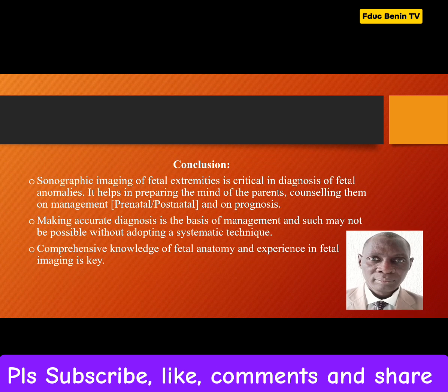Now, distinguished ladies and gentlemen, let me conclude this presentation by saying that sonographic imaging of the fetal extremities is critical in diagnosis of fetal anomalies. It helps in preparing the mind of the parents, counseling them on management, both prenatally and postnatally, and counseling them on the prognosis of the particular condition that is identified in their babies. And making accurate diagnosis is the basis of management, and such may not be possible without adopting a systematic approach, as we have discussed in this particular presentation.